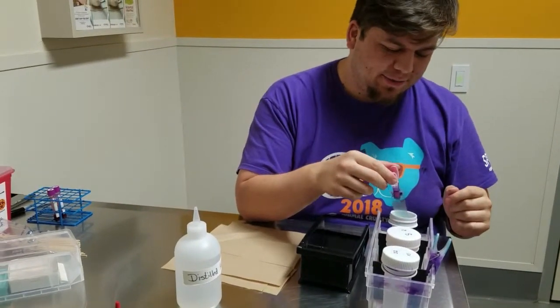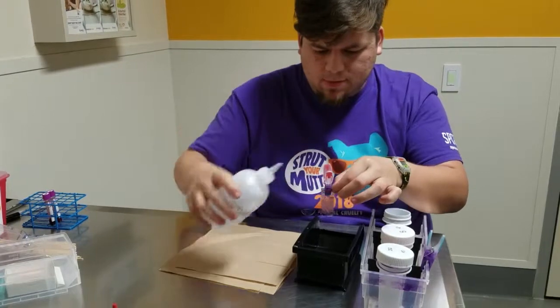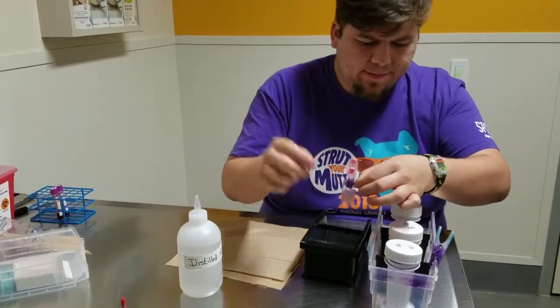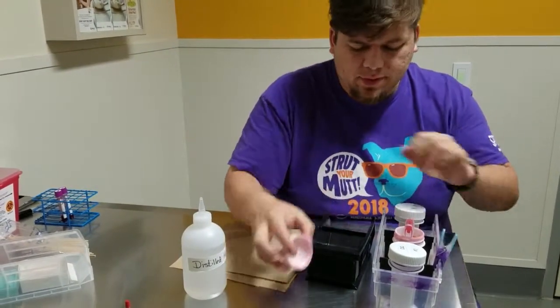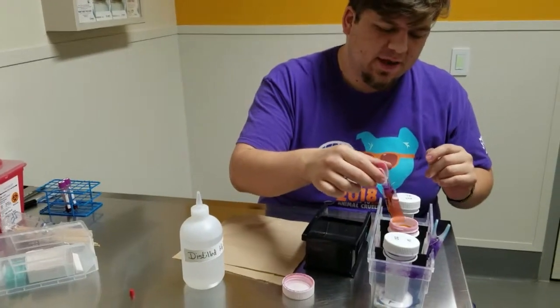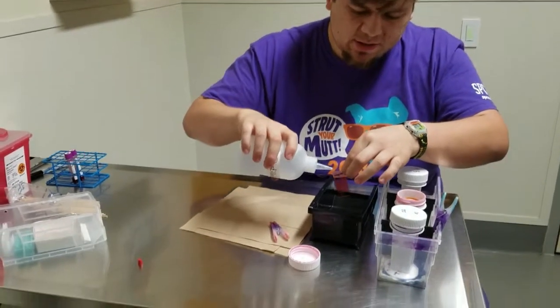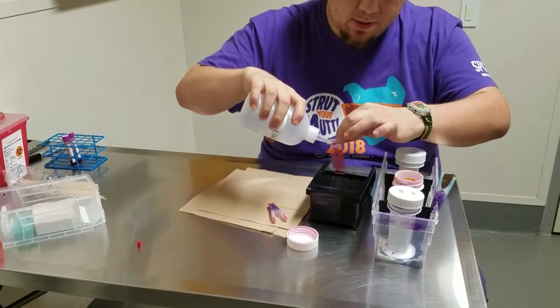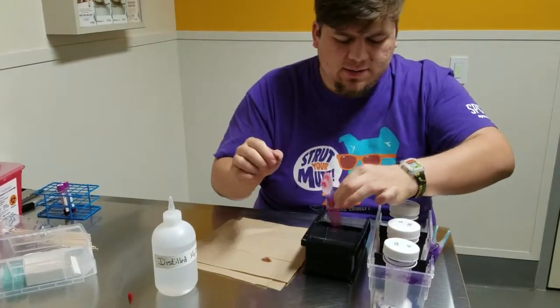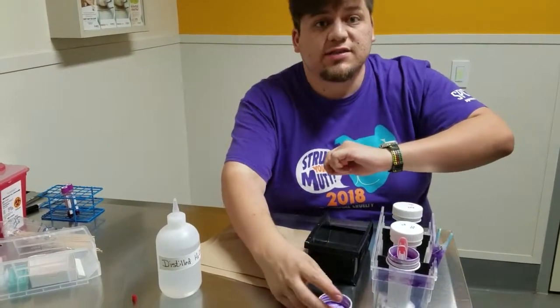It's been 30 seconds. Now I'm going to take it out and rinse it with distilled water. Closing the first dip — now I'm going to go ahead and dip in the second one, wait 30 seconds. It's been 30 seconds, so I'm taking that out and gently rinsing it again with distilled water before I put it in the third one. We're going to wait 30 seconds in the third stain.